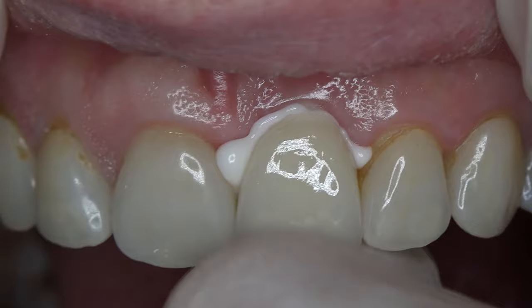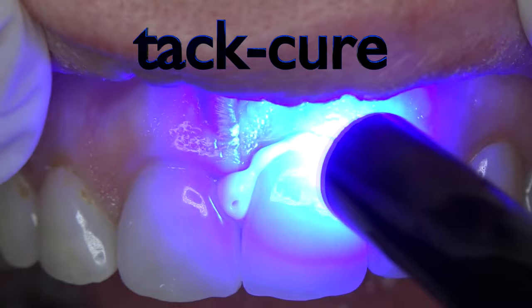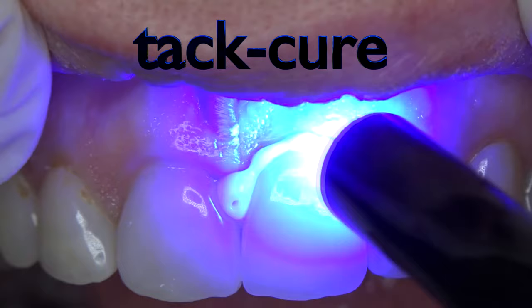Only overdrying should be avoided. Finally, cements allowing pre-light curing should be preferred for easy access and removal around hard-to-reach papilla regions. A cement that becomes gel form in 5 seconds can be easily removed.